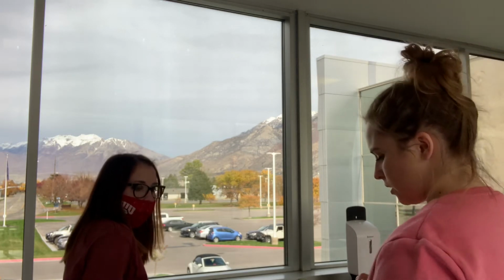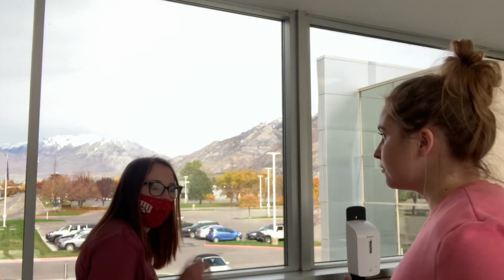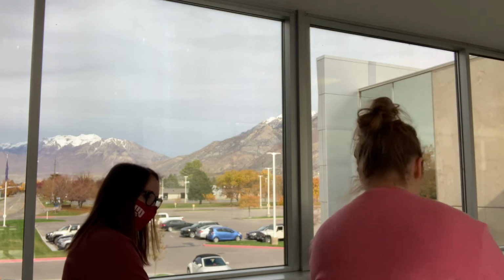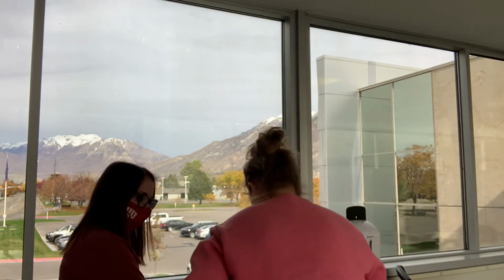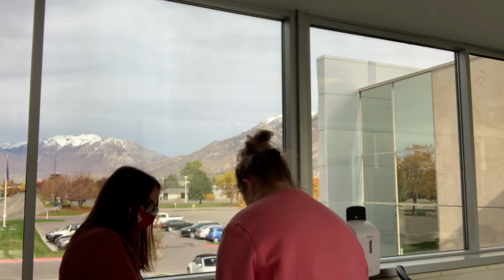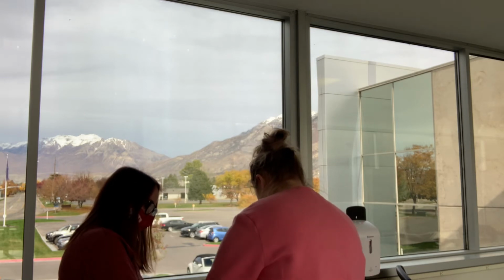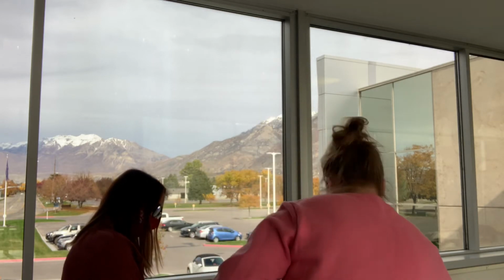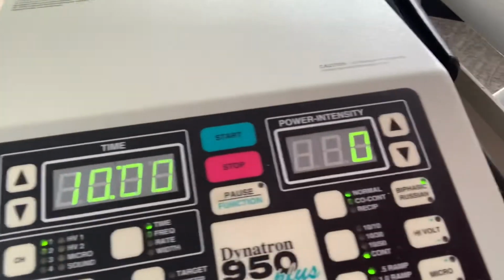Yes. Okay, perfect. If it does ever at any point feel uncomfortable or anything, let me know and we can remove these pads. Okay, so skin looks good and everything, so I'm just going to place these right there and on the medial side of your knee. Okay, and now we will set up the machine.